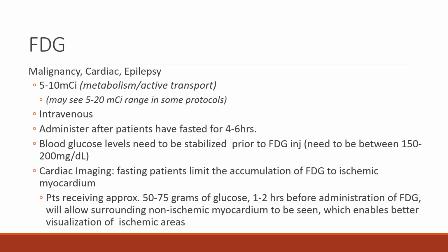But as that breast cancer progresses, they start to lose some of the hormone receptors. They start to no longer look or function like a breast cell, and instead they start to look just like a cancer cell. When that happens and it switches to sugar, it is a sign of disease progression, and it is a sign that the cancer has gotten more aggressive. And so even though you're not typically going to image hormone mediated breast cancer or prostate cancer with FDG, it does kind of change to that over time as it progresses.